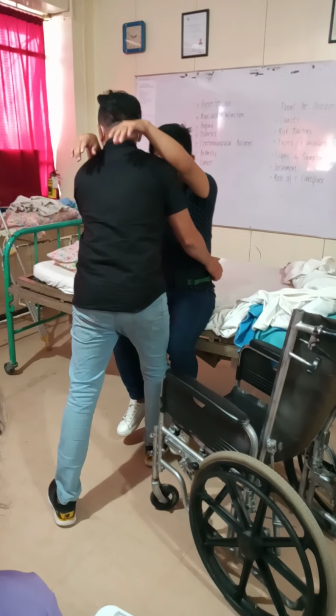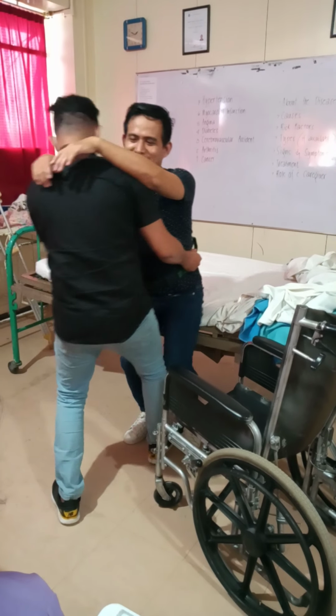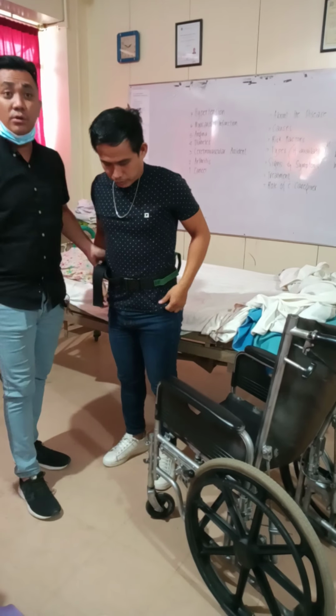Here, then the gait belt. Then, sir, at the count of 3, stand up. 1, 2, 3, stand up. Okay? Then the patient will walk. The patient will walk using the good foot.